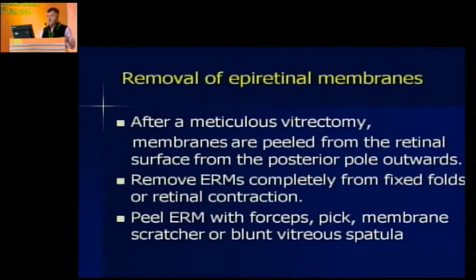So what you need to do is go and remove all the membranes. If you remove that, you are in good shape. Maybe you can see underneath there already, there's a plug, and it is sort of vascularized, and suddenly there's a bleed in that very area, which goes subretinally. So sometimes you have all kinds of challenges in these situations, and you can see now this blood would usually come out, but this can happen.